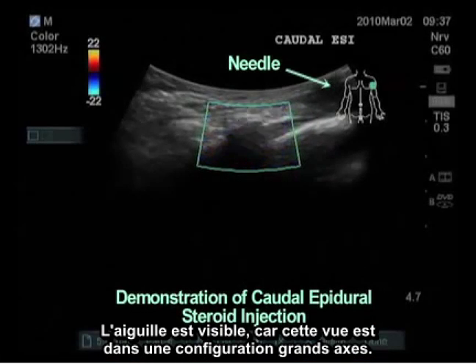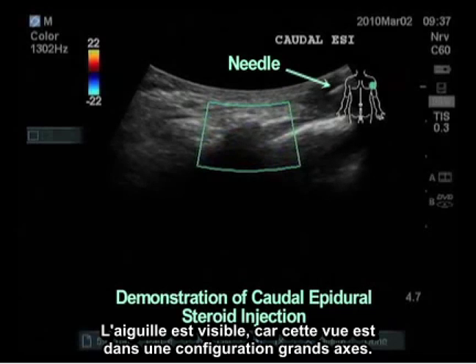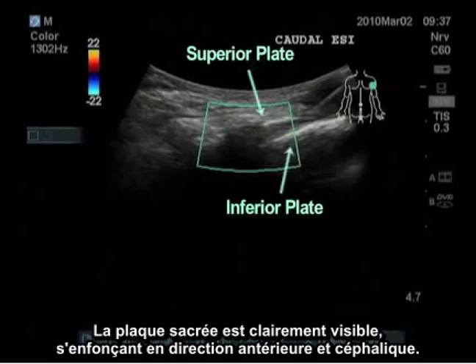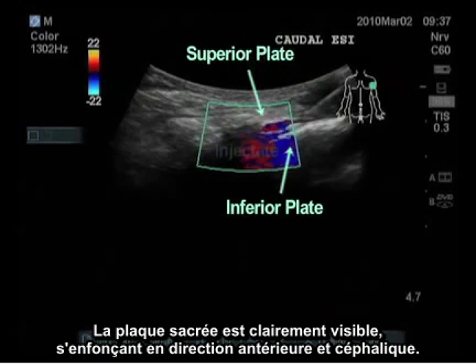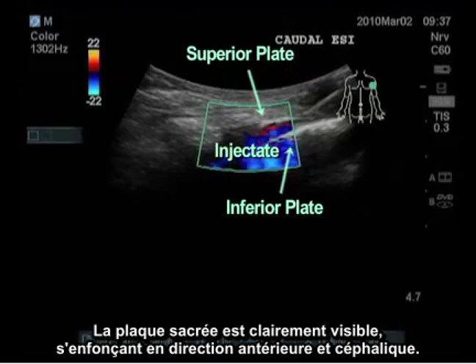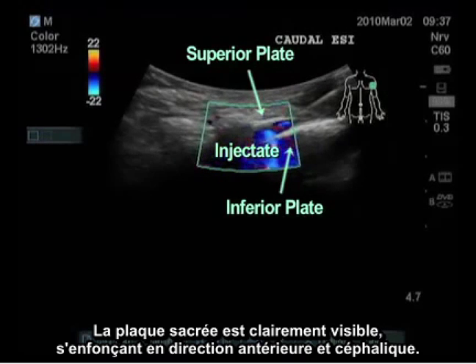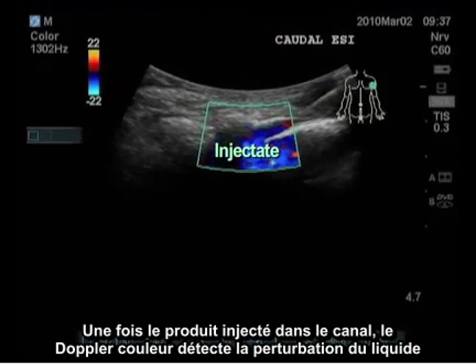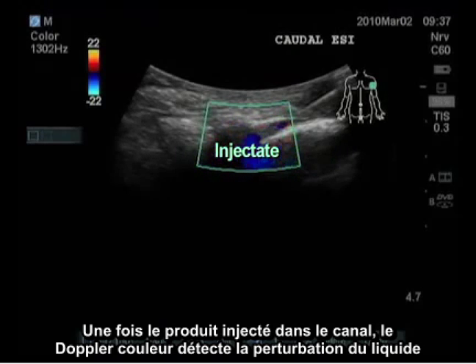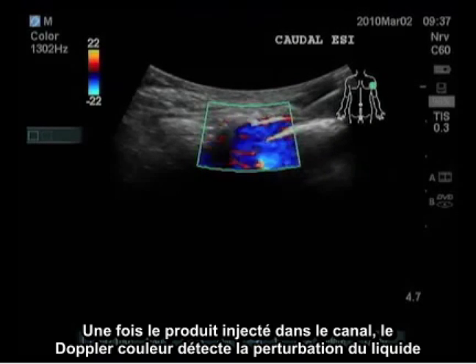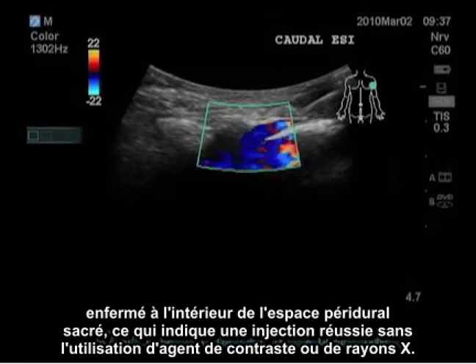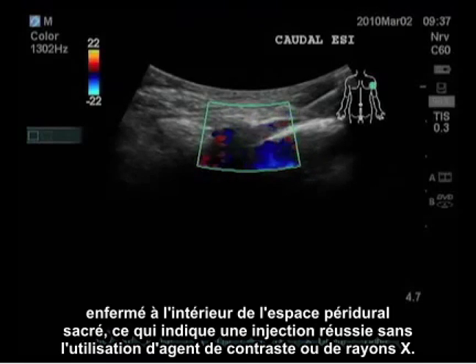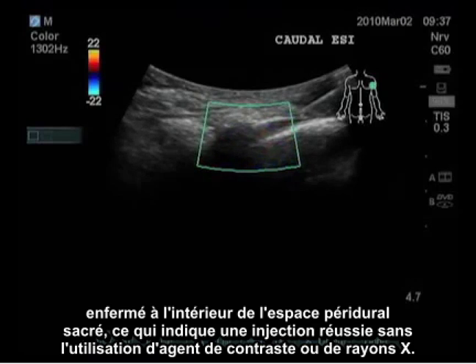Once between the two plates, I would attach my local anesthetic and steroids mix. The needle is visible as this view is in the long axis. The sacral plate is clearly visible, diving anterior and cephalad. Once the injectate enters the canal, the color Doppler shows the fluid perturbation confined within the sacral epidural space, indicating a successful injection without need for contrast or x-ray.